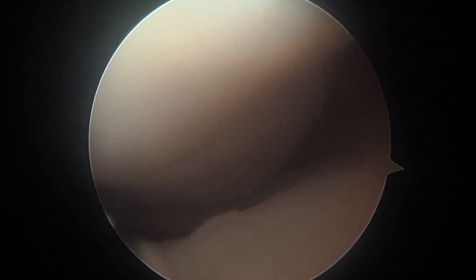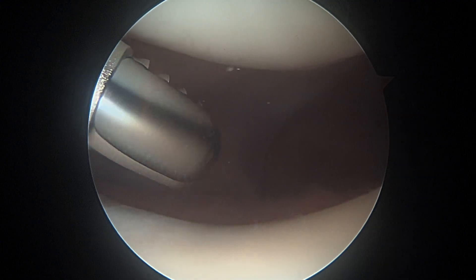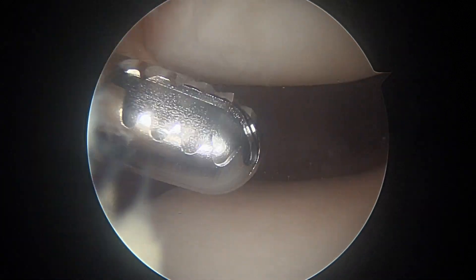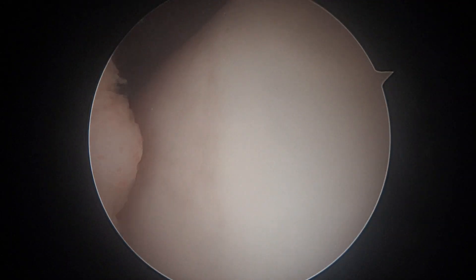That looks pretty good. The articular surfaces look pretty good here as well. So we'll look at the patella next. This is your kneecap, your patella, at the top of the screen — it looks really good. Of all the knees where we have to reconstruct ligaments, this knee probably looks as good as you can and still need an ACL reconstruction, because the articular surfaces look great. You can follow this all the way down the front of the knee. There's maybe a little bit of thinning right there, but that's really not bad at all.